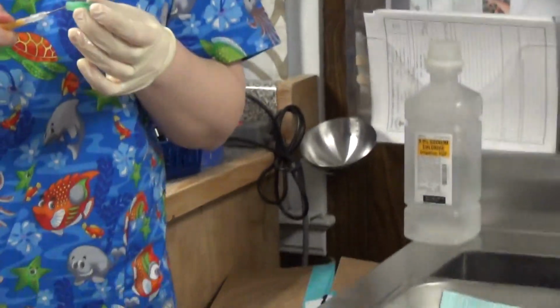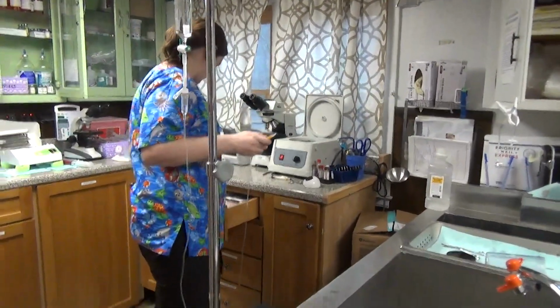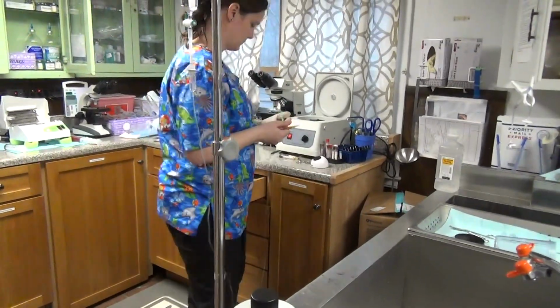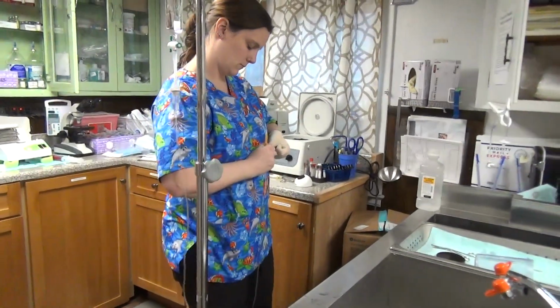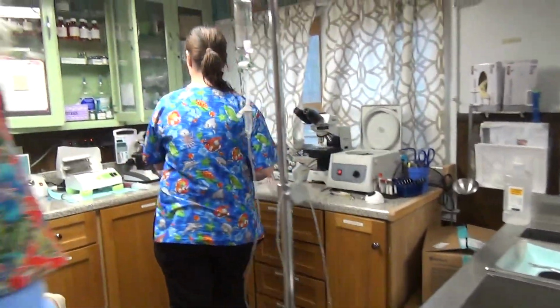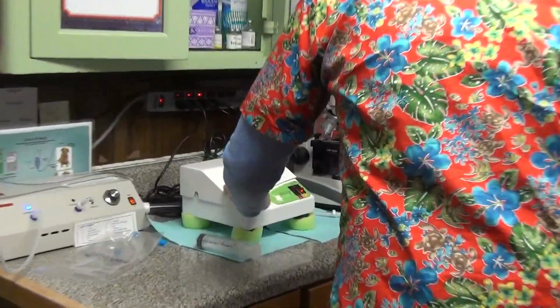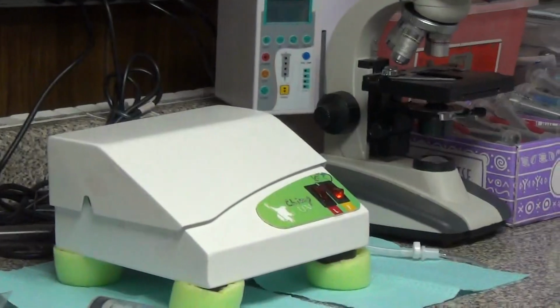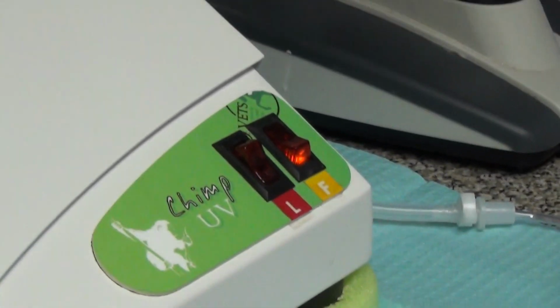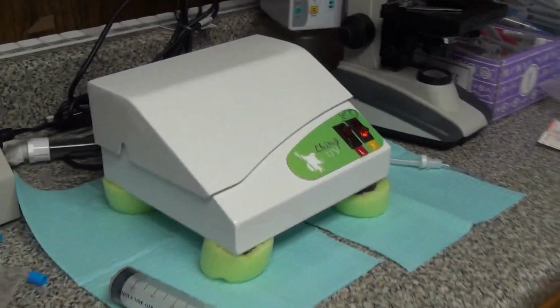Okay. And of course that needle will be changed because it touched the blood of the other animal. Okay, so that's all set there. So with the machine, you want to make sure that you close this down, leaving the fan on to cool the bulbs. Because as the bulbs are heating, it needs to be cooled a little bit because that'll keep the life of the bulb a lot longer.